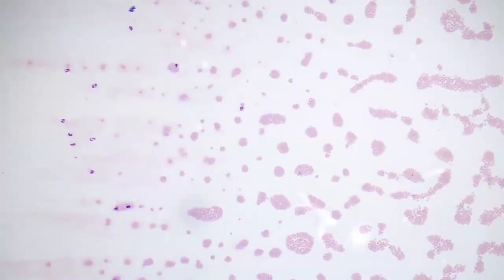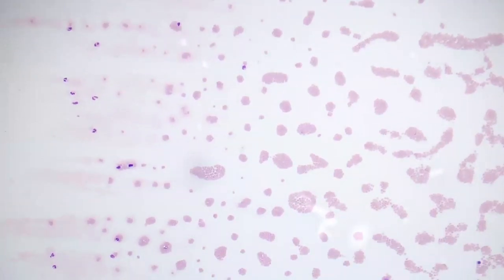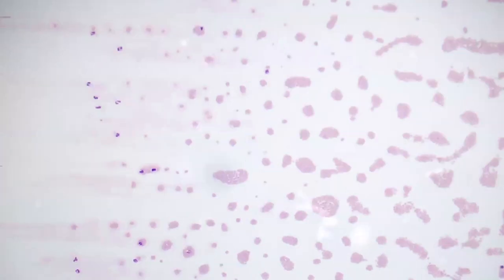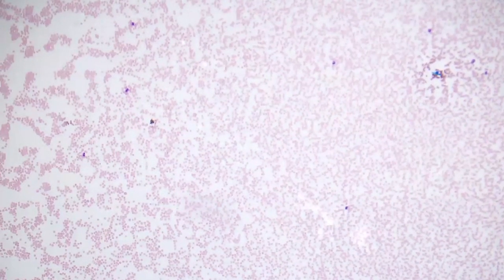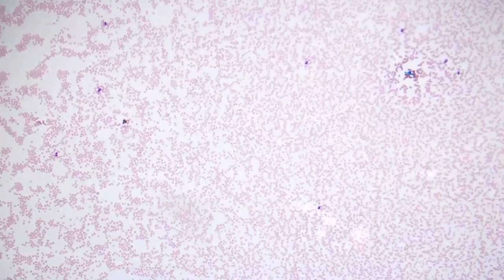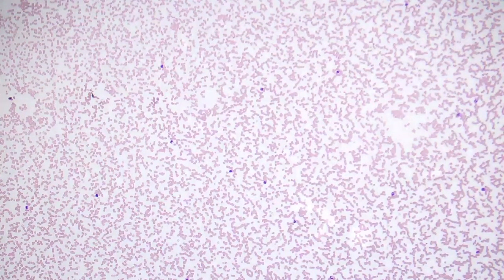Agglutination is different than rouleau, and here we'll see an example of rouleau. And so as we move in from our feathered edge to our zone of holes, we can see that the zone of rouleau really comes into focus in our usual area of zonal morphology. And so I'll repeat that. As we move in one 10x field, we should see our zone of holes, which is effectively gone in this specimen. And we'll go one more 10x field in, and you'll notice that all of the red cells here are stacked up on one another like a stack of coins. And so this is the difference between rouleau and agglutination.